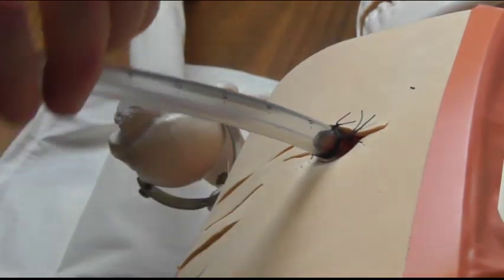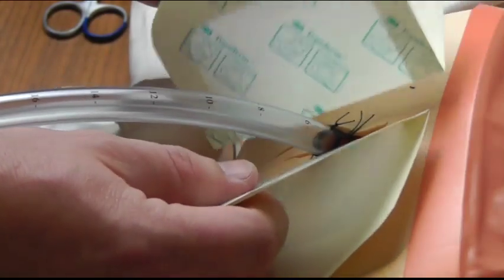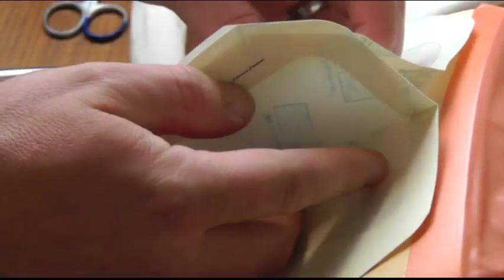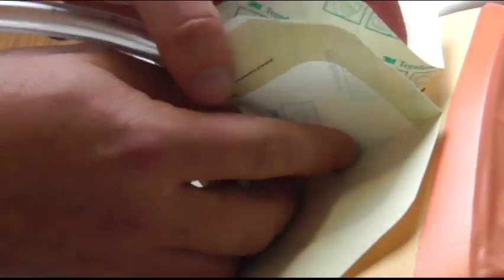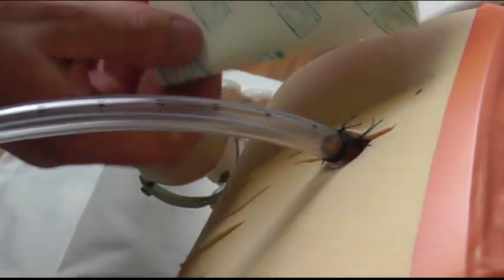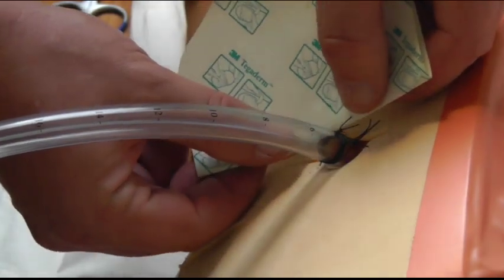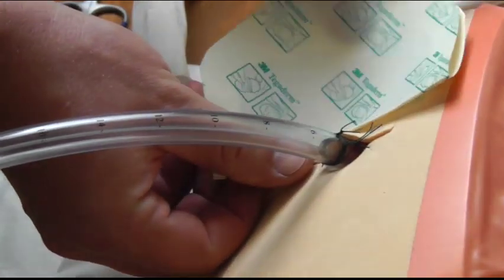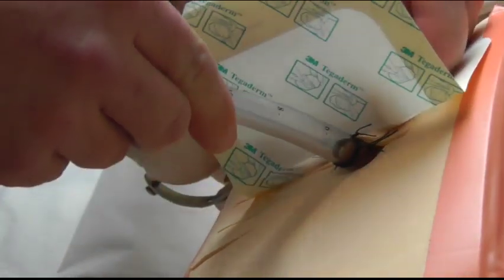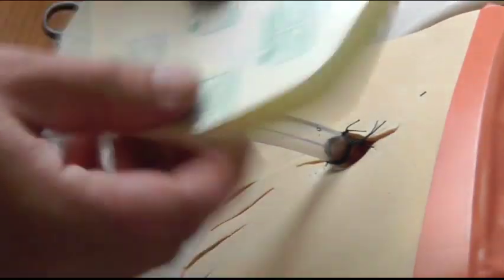What you then do is you're going to put one on either side of your tube laterally along the chest wall and make what they call a sandwich dressing. When you're doing this, it's important because they're very sticky. As soon as you take this backing off, you want to get it right up against the edge of the tube before you stick it down and right down against the skin before you wrap it up against the tube. Same on the other side.